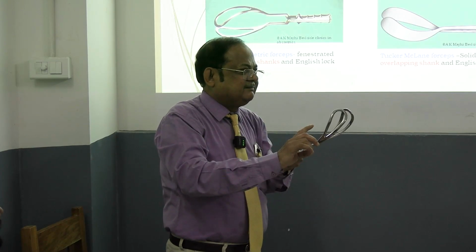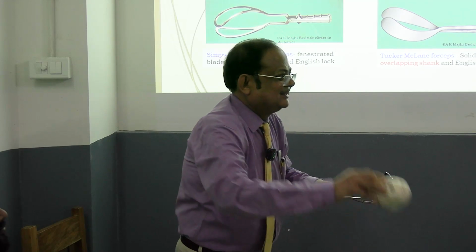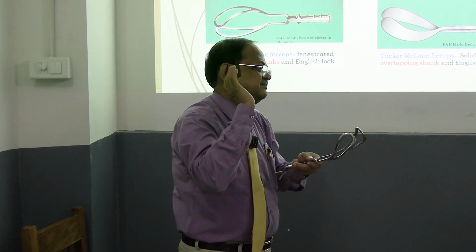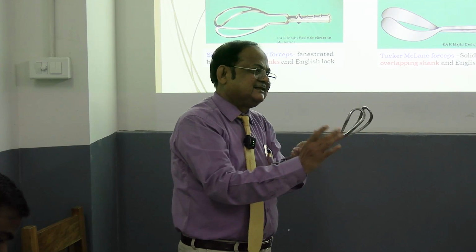But the advantage of the fenestrated blade is good gripping of the fetal head. There is less chance of slipping. In a solid blade there is a chance of slipping, but the disadvantage of the fenestrated blade is injury to the maternal surface.